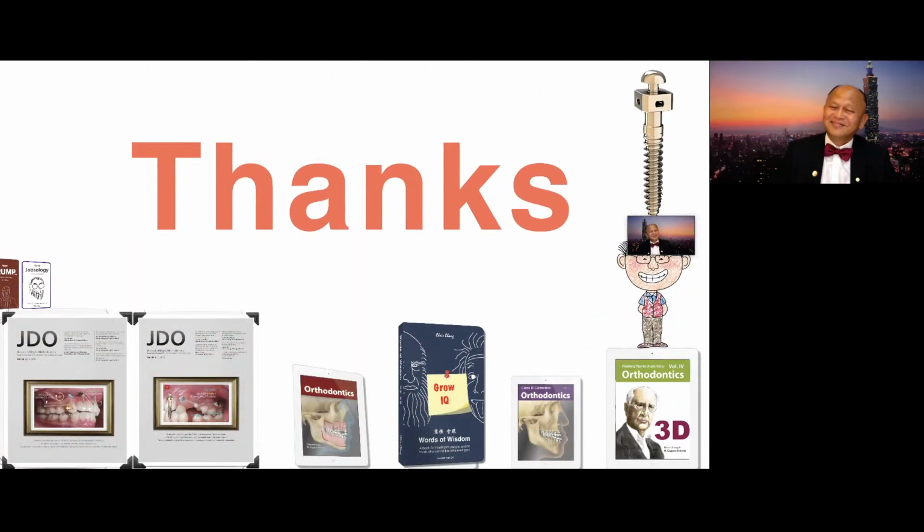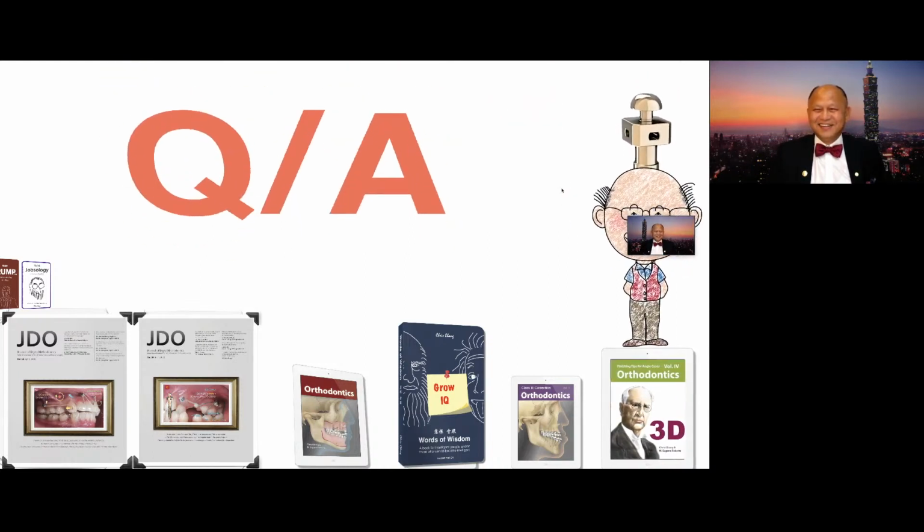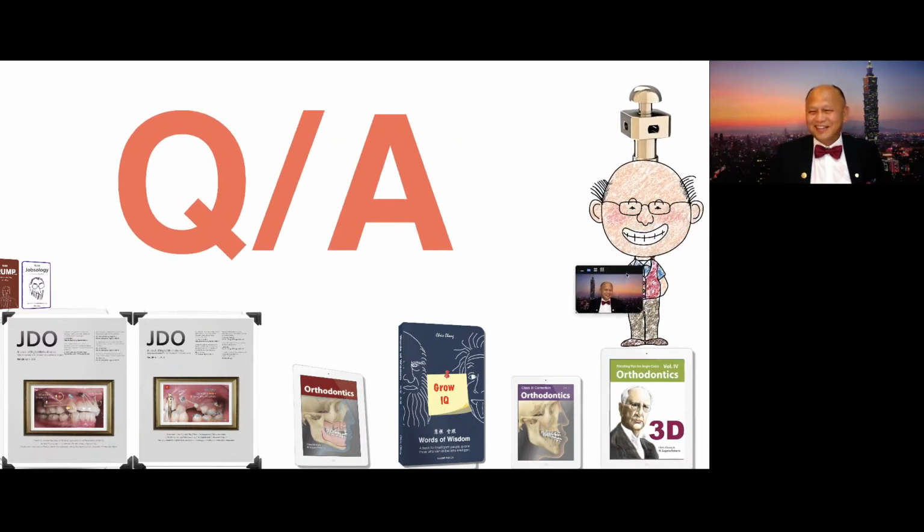Thank you, Dr. Chang. As usual, a beautiful and enlightening lecture. And we have some minutes left for the questions, and we've got a lot of questions here. I'm going to try to choose some. The first is related to the bite turbo. And she's asking, when you placed the anterior bite turbo and said it took 3 months, did you just let the patient go and the posterior teeth erupted spontaneously before you started aligner treatment?